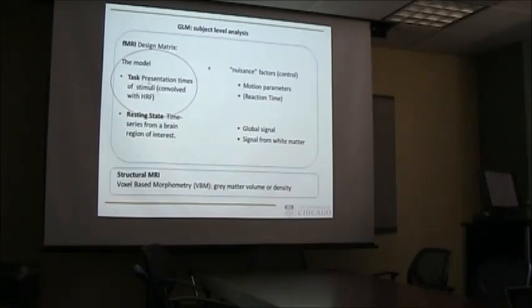And you can even do, also within the task framework, analyze the interaction between the response in a region and the task related activity, and you get a PPI model. It's all more advanced analysis. The basic is task fMRI, but it's good to realize that the setup is really similar, whether you do task fMRI, resting state, or task connectivity. You're always trying to fit this model. Just the things that you include in the model differ from analysis to analysis.